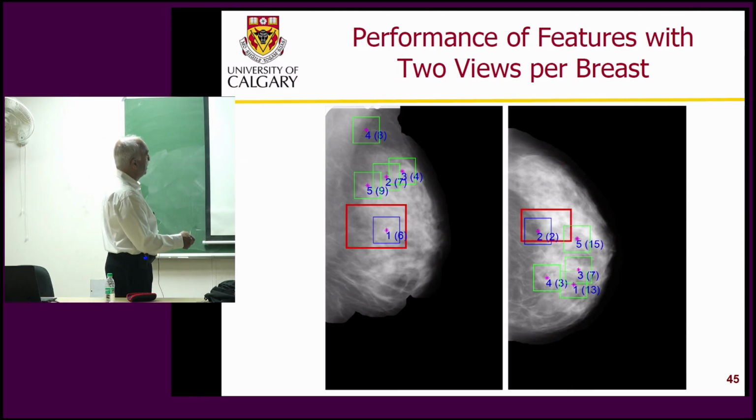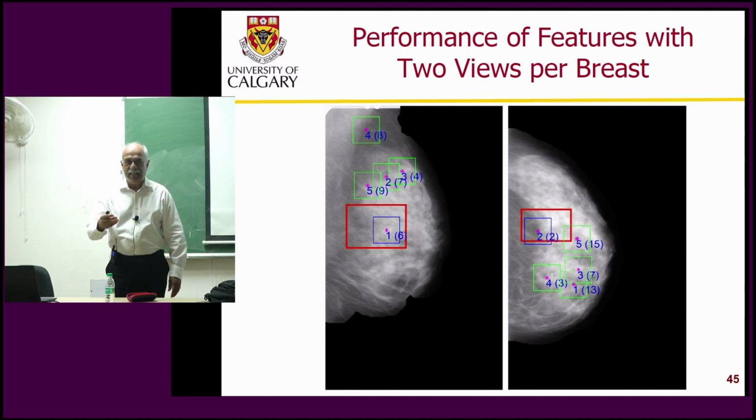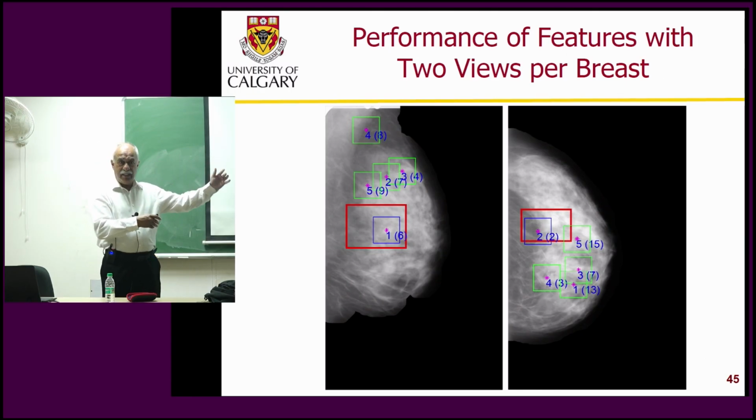So number 1 is here. Number 2 is there. Number 1 here went somewhere else. So the others we don't care. After you rank order, then you still go through ROC analysis, FROC, and then say how many of these are number 1 and 2 and so on. You could do that, or give the sensitivity against false positive rate.